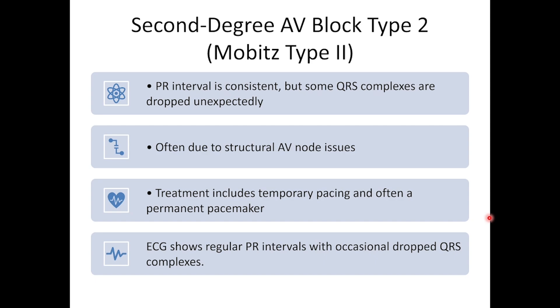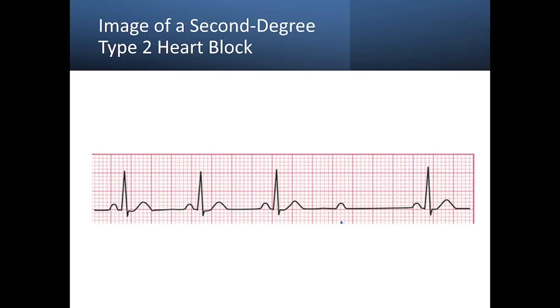Next, let's talk about a second-degree type 2 AV block, also known as a Mobitz type 2. This type is much more dangerous and often requires immediate intervention. In a second-degree type 2 AV block, we don't see the progressive PR interval lengthening seen in type 1. Instead, there's a sudden unexpected failure of conduction — the PR interval remains constant, but some atrial impulses simply don't make it through the AV node to the ventricles, resulting in a dropped QRS complex.